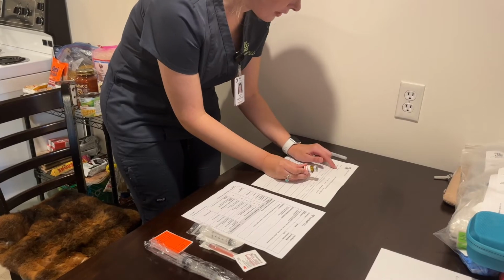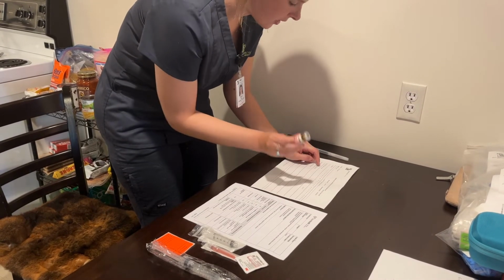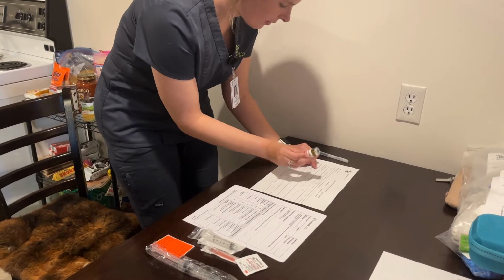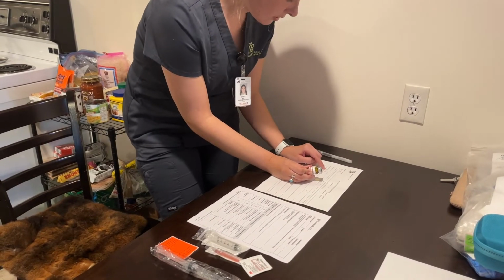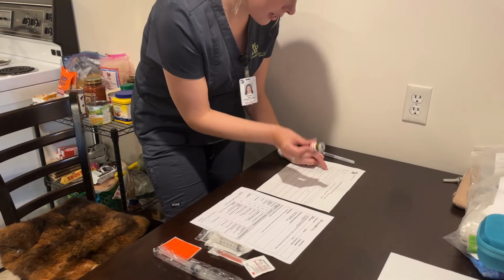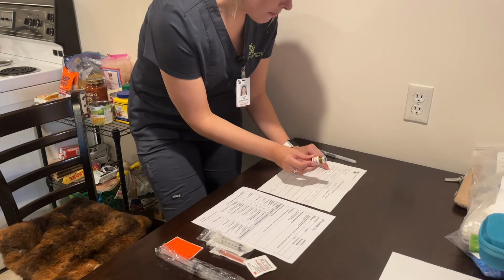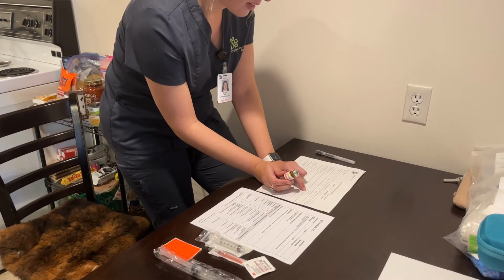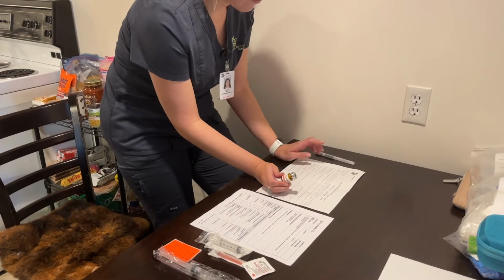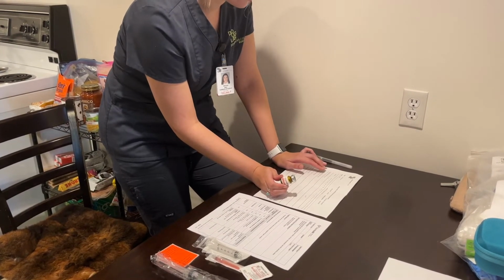We're going to check for the right patient, so Soft Whispers, the right drug, furosemide, the right route, which is IV, the right dose, so 40 mg, so there is 4 mils in here, and it is 10 mg per mil. The right frequency and the right time, so it is at 4 o'clock, and we are giving it due to his congestive heart failure.